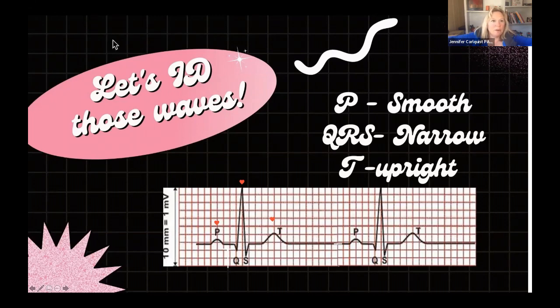And the other thing I wanted to point out to you on this is the importance of knowing this segment. Okay, what is this segment called, by the way, you guys? This segment is a very, very, very important segment. And it's what we use. Yeah, good. Oh, hey, Samantha, you're here. So this is actually, right here, the ST segment.